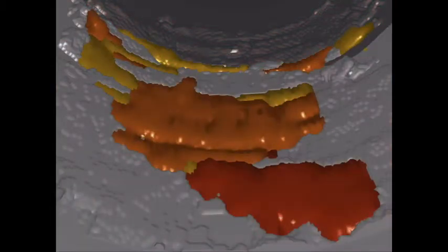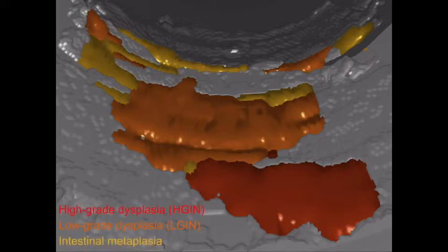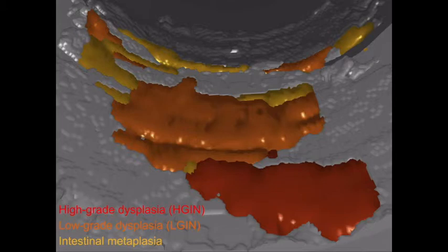Mapping the histopathological diagnosis to the virtual endoscopic view provides an augmented virtual endoscopy. The red color indicates that the island closer to the camera corresponds to high-grade dysplasia, indicating a higher degree of dysplasia than the more distal island, for which the orange color signals low-grade dysplasia.